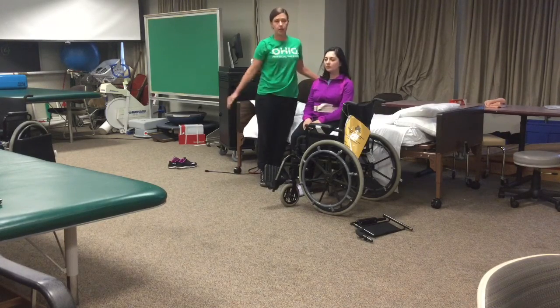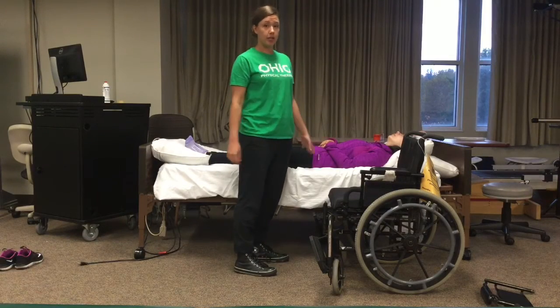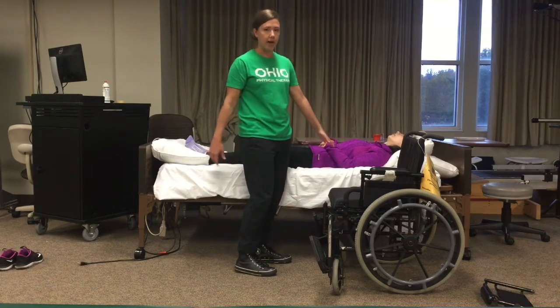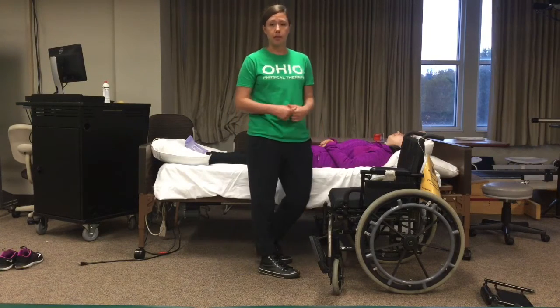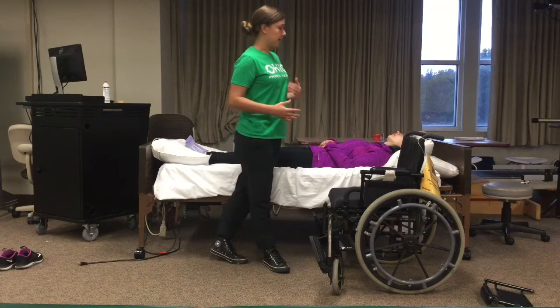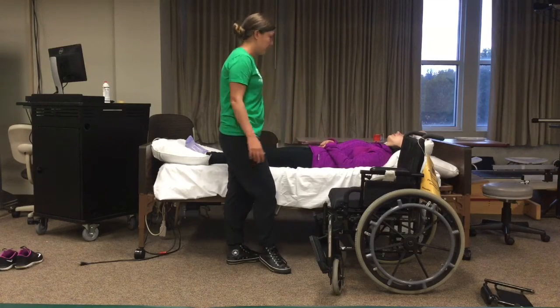Are you ready? Yes. 1, 2, 3, up, pivot, and you wanna support the patient as they come back up to sitting. So your skill is completed when the patient's secure in their new resting position. Again, you could refer to skills 7 or 8, lying the patient supine. I'm making sure bed rails are up, if she's in the wheelchair her lap belt's secured. We want to make sure she has any equipment that she needs, call button, anything nearby, and also make sure the patient's comfortable, adjusting any pillows or blankets.